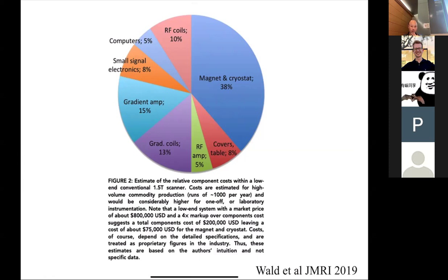No. Okay, all right. So we're going to end with a little bit of discussion that I think we touched upon at the beginning, but now that you have a better sense of what goes in an MRI system, hopefully this will make a little more sense. That MRI traditionally has been super expensive, right? It's $1 million per Tesla, right? So if you want to buy a 3 Tesla system, it's about $3 million.